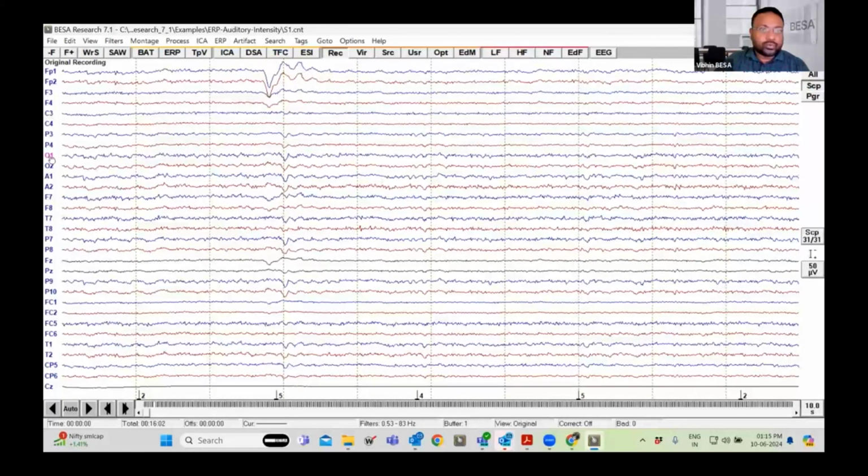Next, if you define this channel as bad, it gets grayed out, indicating that this channel has been marked as a bad channel. But this one is neither bad nor has an artifact, so I just want to remove that marking and make it as it was.